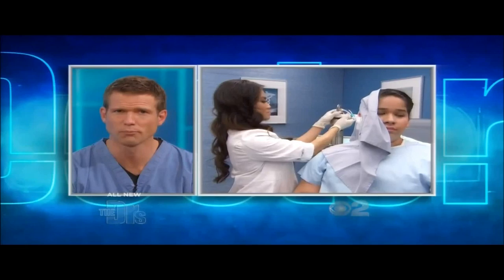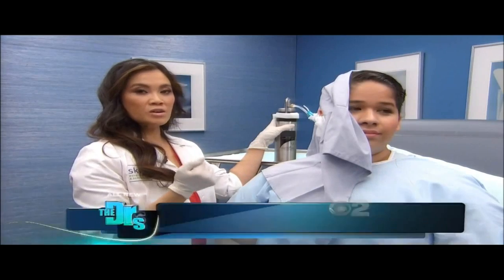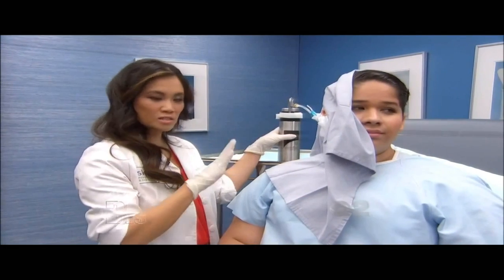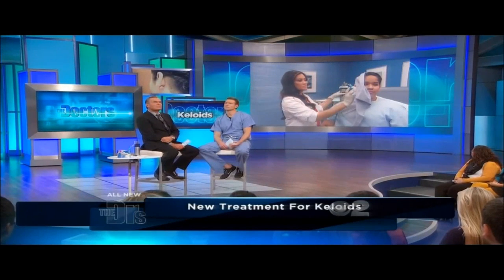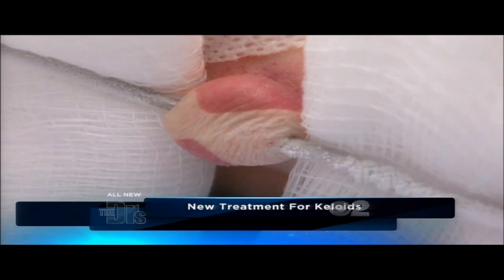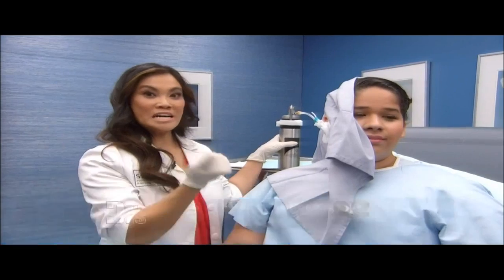And Stephanie's backstage with board-certified dermatologist Dr. Sandra Lee. And Dr. Lee, you're going to be using a new type of treatment on this? Right. This is a new device called the CryoShape. And what is so neat about this is it really takes one of the concepts that we already have. We have used cryogen, which is liquid nitrogen. It's over 300 below Fahrenheit. And we usually have, in the past, tried to freeze keloids, but we can't get to those cells down deep. And so in this case, they've just made a probe. And when we insert the probe in the center of the keloid, as you can see here, it freezes it from the inside out radially. So you're really getting to all of those cells. And it's just so cool. It's kind of like, why didn't I think of that, you know?